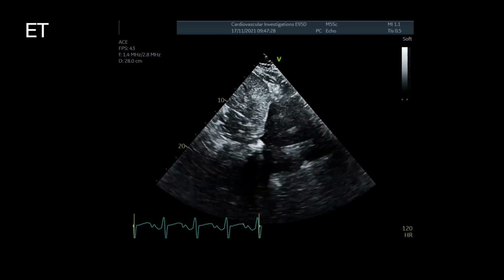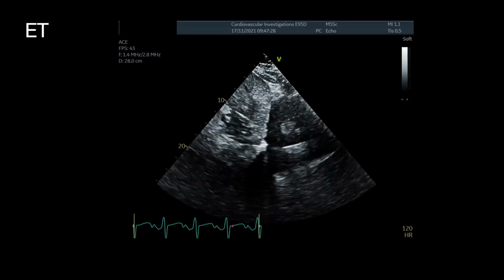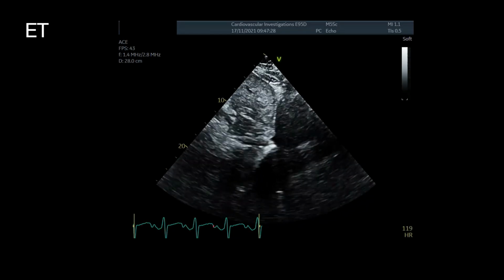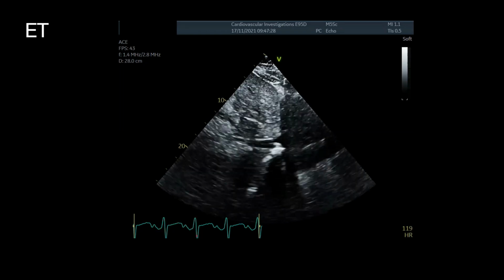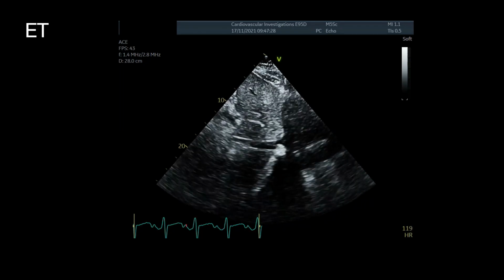And for our purposes, that's probably enough. RVSP is definitely the pressure I measure the most, and that a lot of us will measure the most. Sonographers and cardiologists will measure the other pressures. They have other reasons to measure them, but for us, RVSP is usually enough.